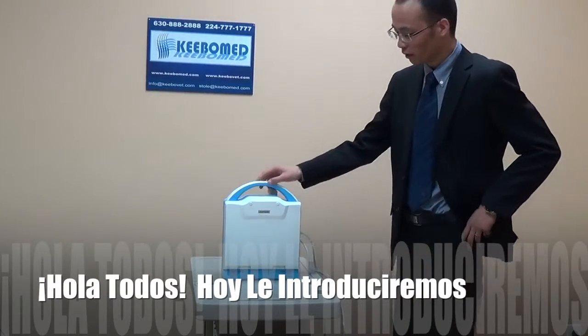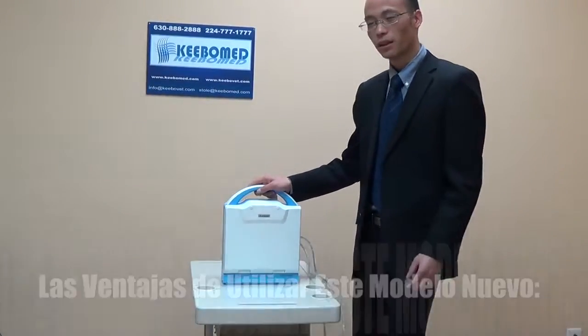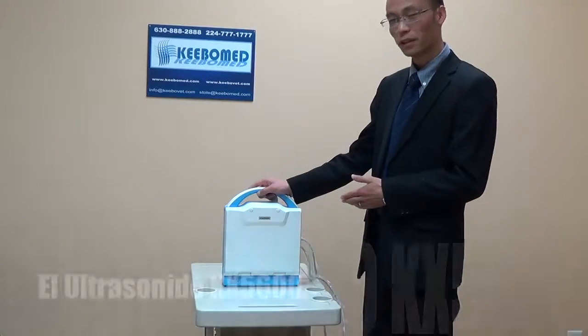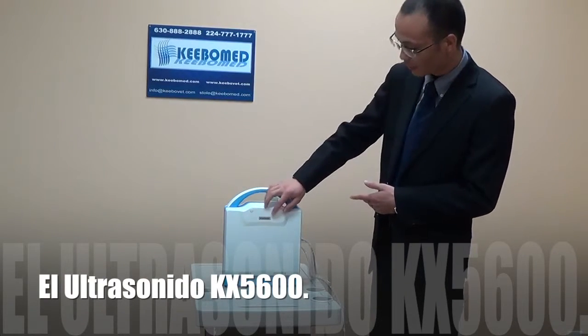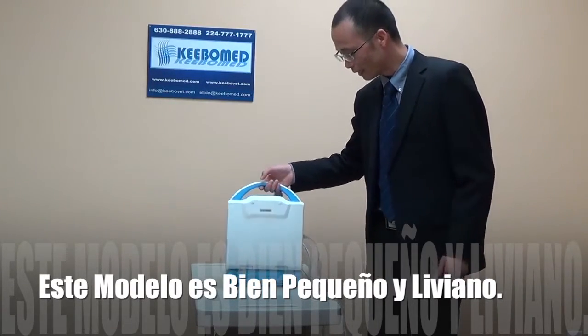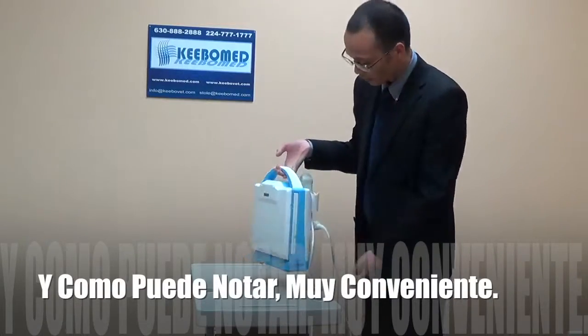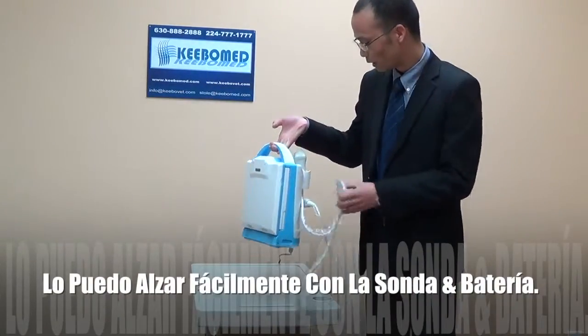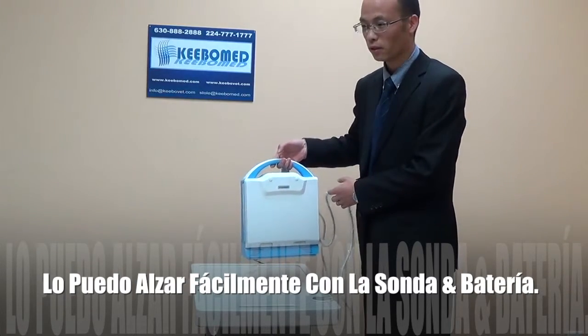Hello everybody. I will introduce the advantages of this new model, KX5600. This model is very small and very light, very convenient. As you can see, I can pick it very easily, including the probe and the battery. It is just 10 pounds.